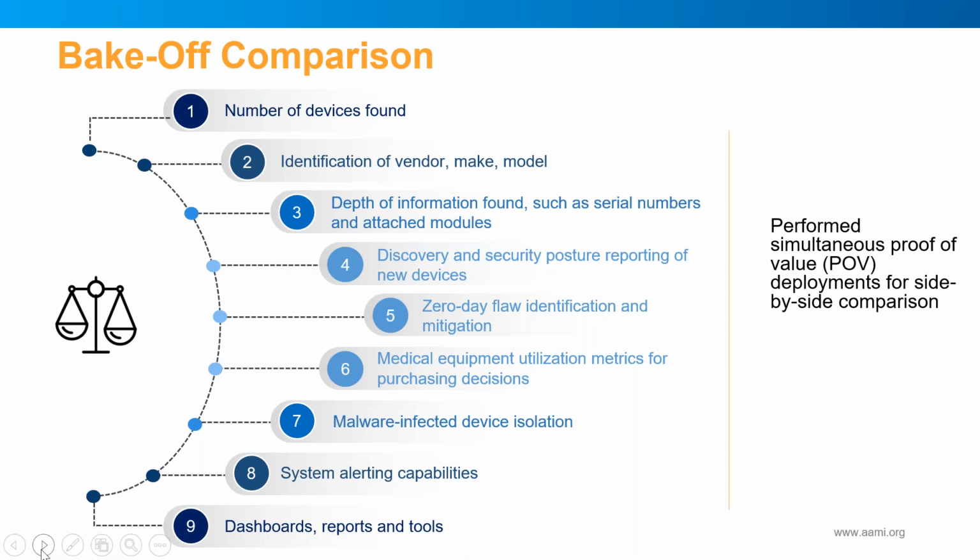It's a very manual process, having to go back and look at your device inventory, looking for a specific manufacturer, model, serial number range, software range, and this system here was able to pull that information for us. So some of these vendors, you'll see that they have a service that goes along with the product, usually on a contractual basis, that they will provide and feed in FDA recalls and alerts into this application, and it will automatically sniff out of your inventory which are your affected devices.